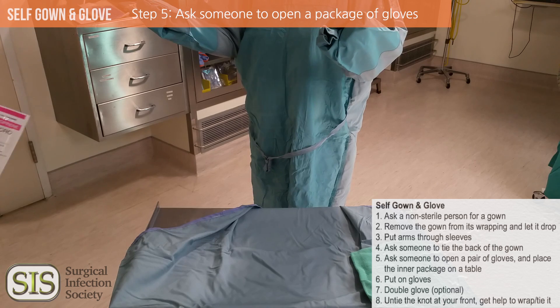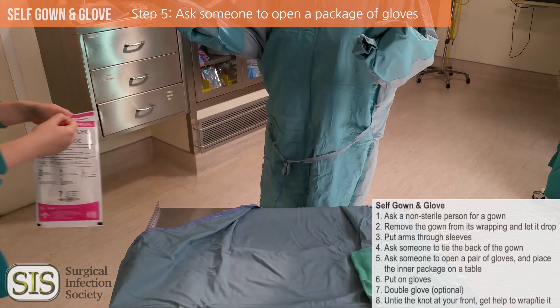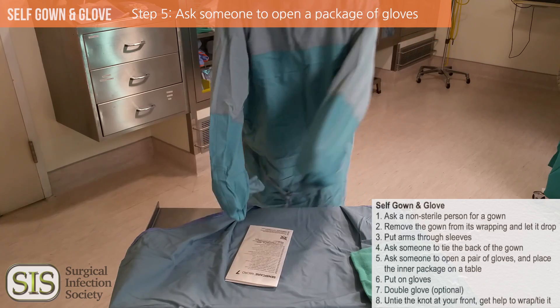Ask someone to open a pair of gloves and place the inner package on the table. Carefully remove the gloves in their package using your hands that are wrapped up in your sleeve. Place the gloves in the inner package on your sterile field.